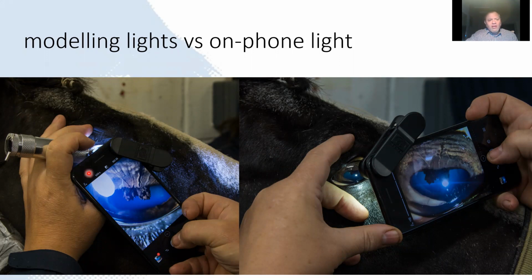But when I look at the other image, where I'm not using the on-camera flash, but using a light from the side, oblique lighting or modeling light, we can see that this image is much more three-dimensional in appearance, because we're getting the shadowing. So having an oblique light will actually show us things which we can't see with coaxial light. And being able to do both is very, very useful, as in Trigger's case at the beginning of this talk.